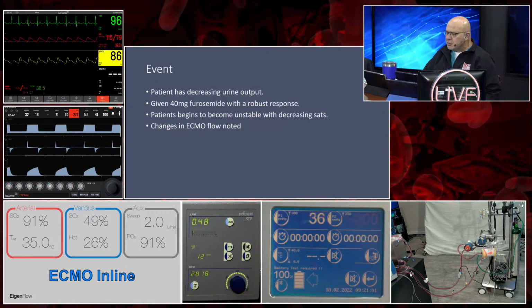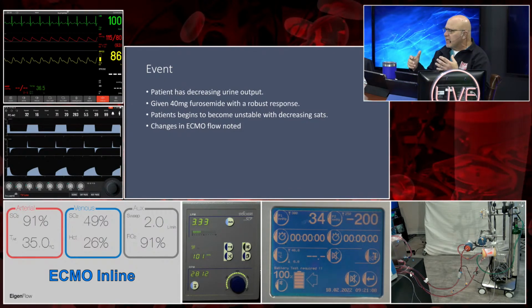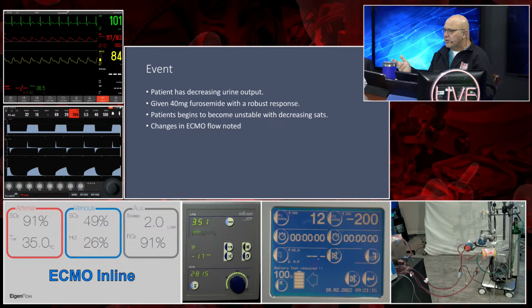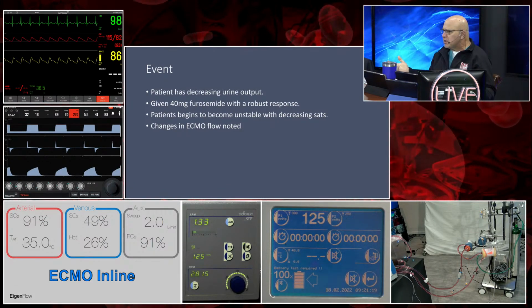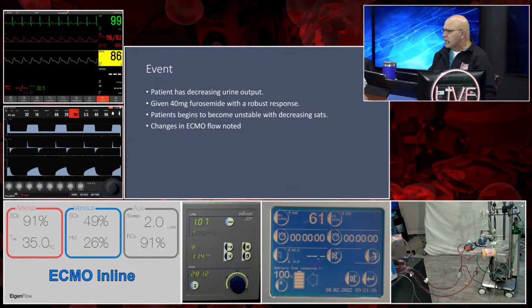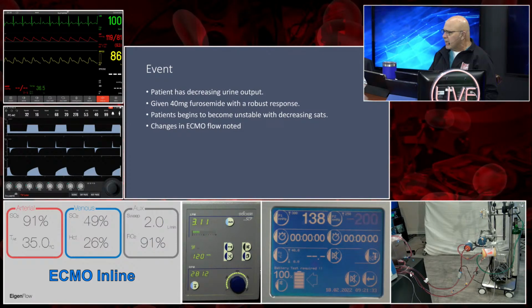Yep. And that's usually caused by an obstruction of the access line as the vena cava are collapsing around your access catheter. You also clearly note that you hear a lot of alarms going off. Your patient saturation is being compromised because your flow has significantly changed. And you also see your pressures, access and return pressures, more your access pressure, vacillating wildly.